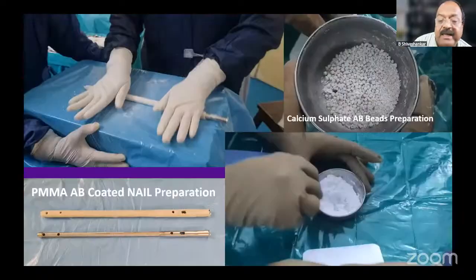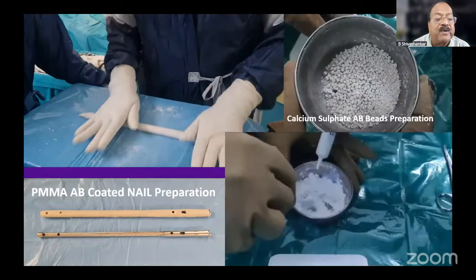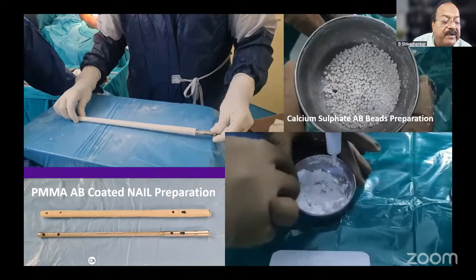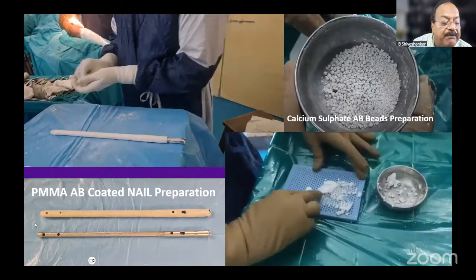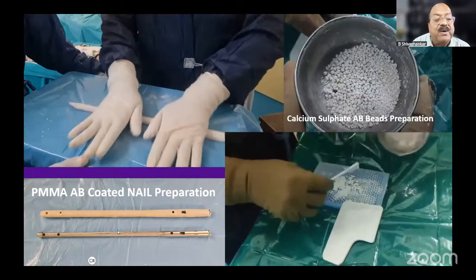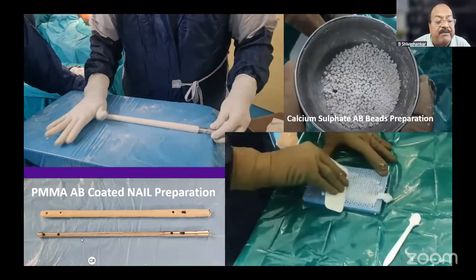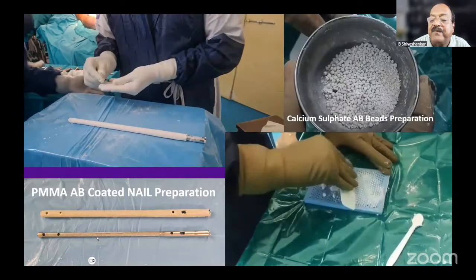And once I did that, how we prepare the antibiotic coated nail. So these are straight nails. These are serrated nails, and there is a small stub at the tip. So this tip is 9 millimeter and this is 7 millimeter, or the tip is 11 millimeter, this is 9 millimeter. So the rod is 2 millimeter smaller than the tip size, so debonding of the cement will not happen. Another thing, it is knurled so that the cement gets fixed very well.